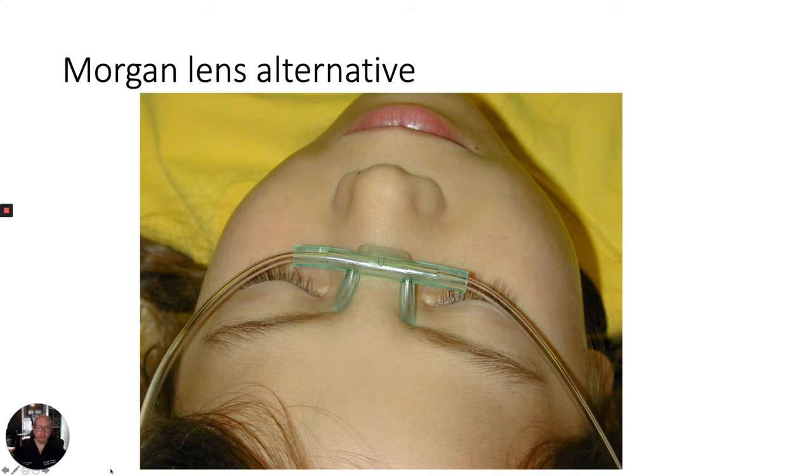If a Morgan lens is unavailable, you can accomplish the same task with a simple nasal cannula. Just connect the nasal cannula to IV tubing, place the cannula over the patient's nasal bridge with one prong aimed towards each medial canthus, and adjust the desired flow rate — this will irrigate the patient's eyes. It's important, however, to instruct the patient to keep their eyes open so that the irrigation actually goes into their eyes, and to add tape between the IV tubing and the nasal cannula tubing so that there isn't any leakage of fluid.